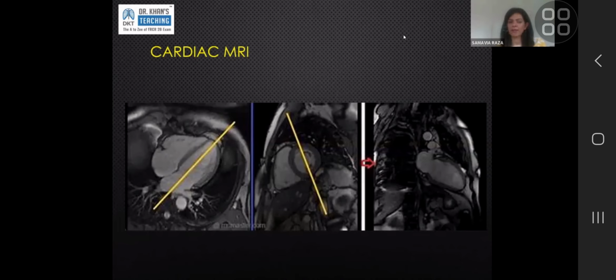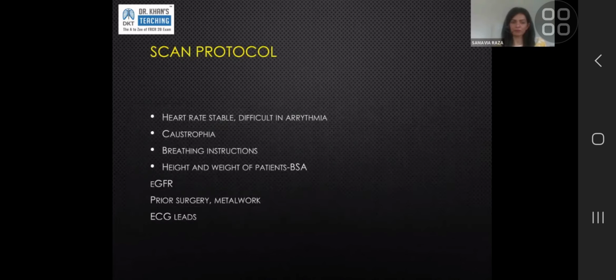It doesn't need the patient to be in a certain position. It can acquire images going off its localizing sequences. So it will acquire the four-chamber, draw a line through it, get that view, and so on. It will keep cutting and getting further and further views, and all those views will be catered towards the heart rather than the thorax.